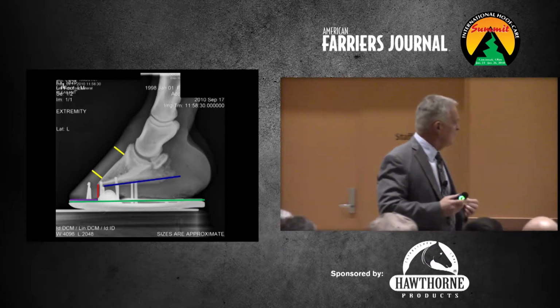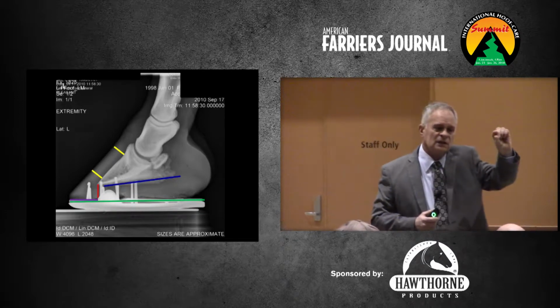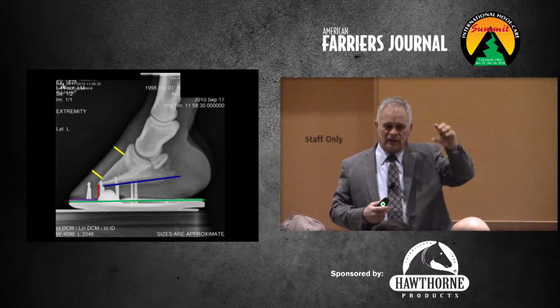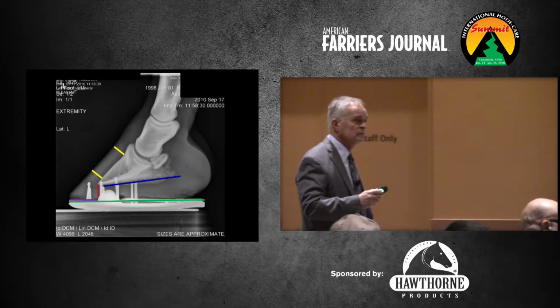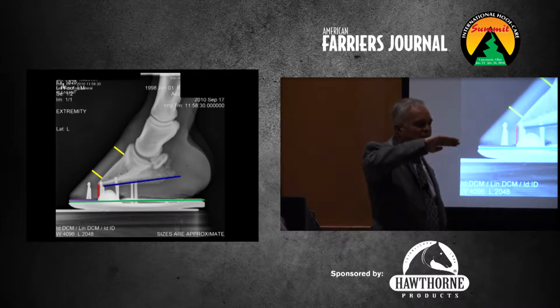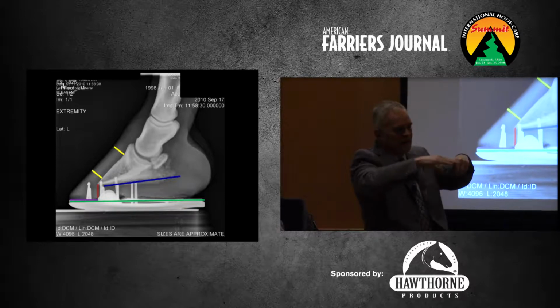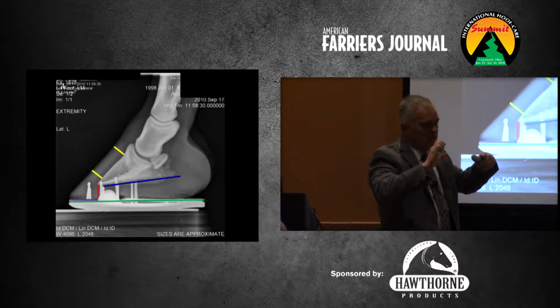Putting some barium on it, if you were just measuring true hard sole, yes, you could do that. So again, that sole depth is a little misnomer because it's actually the dermis, the epidermis, and then the cup. True sole thickness is kind of hard because if you have a concave foot, you're radiographing across something that arcs, so you can't get an exact thickness of it.